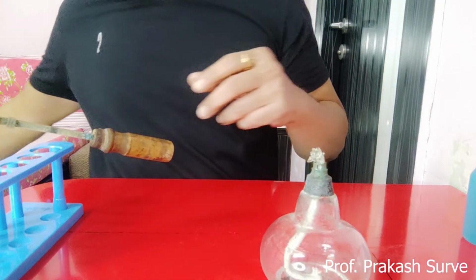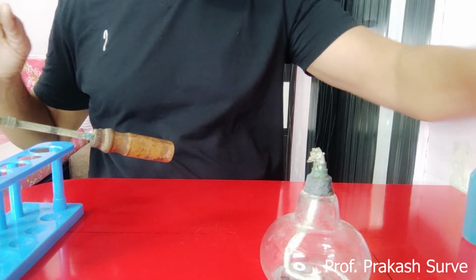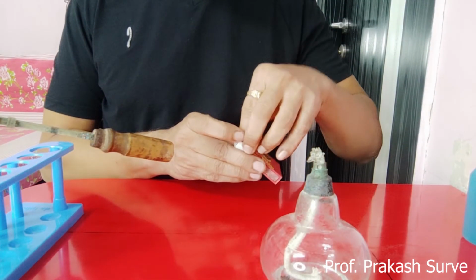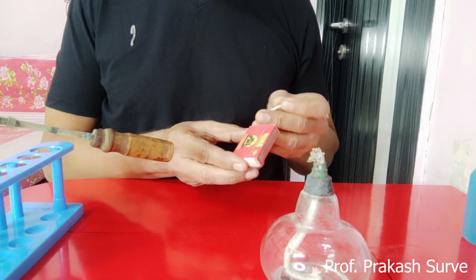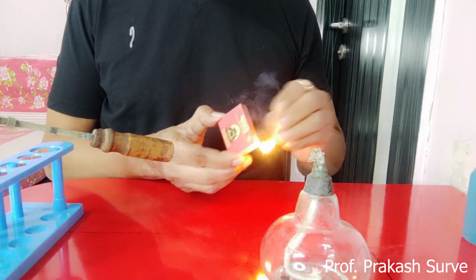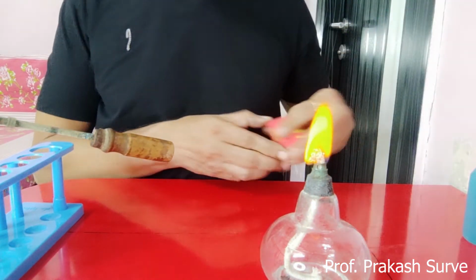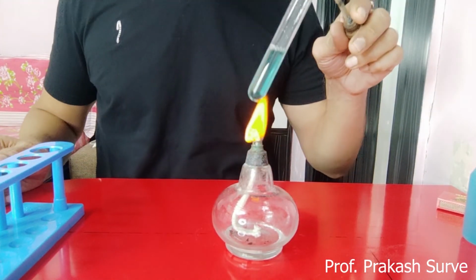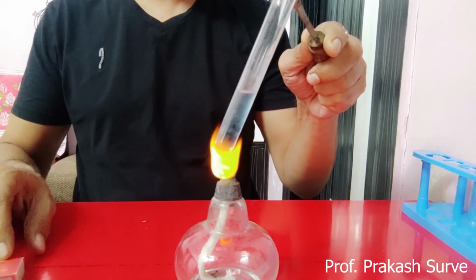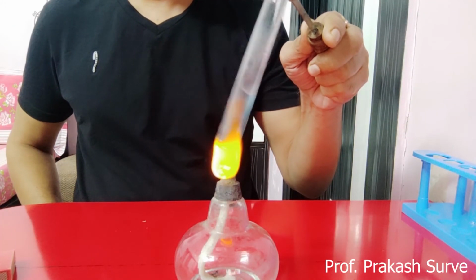Now here we'll hold this. So this you have to boil for 2 minutes.